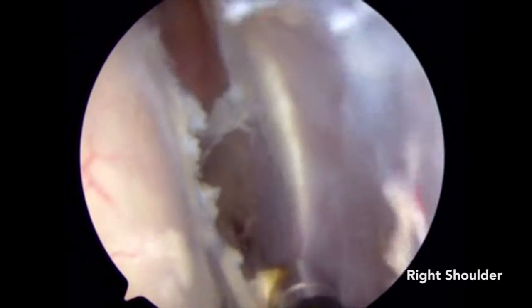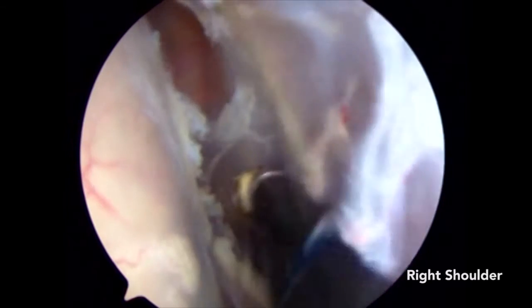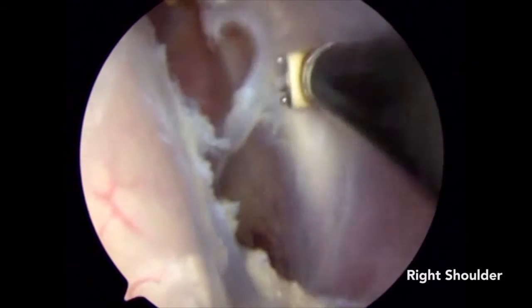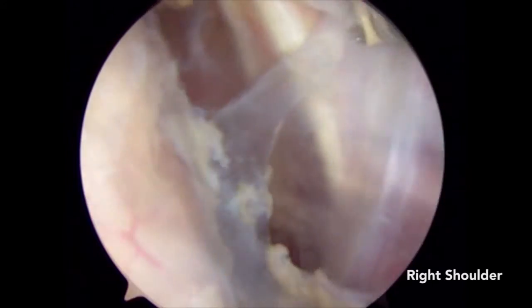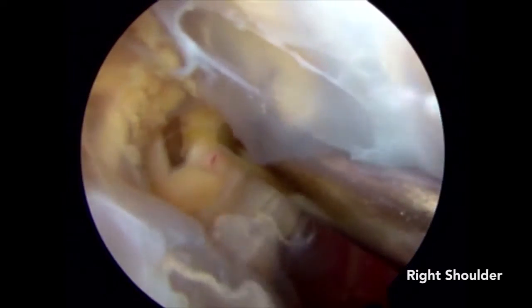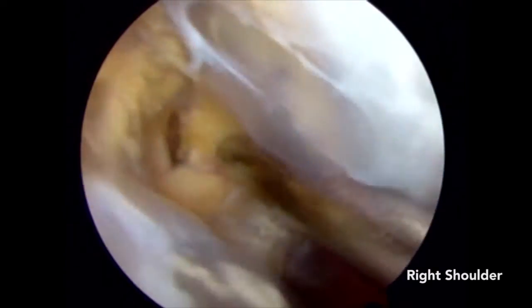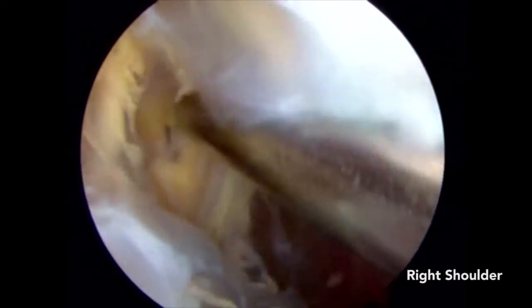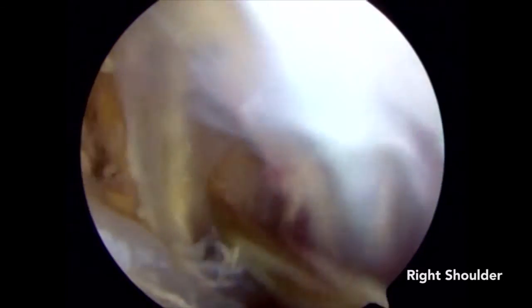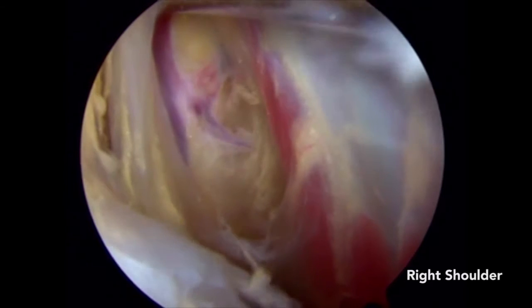With the arthroscope in the anterolateral portal, adhesions are carefully taken down bluntly and with an electrocautery device. Using a switching stick, soft tissues are carefully divided. Great care is taken to not violate the axillary artery that runs nearby the axillary nerve.